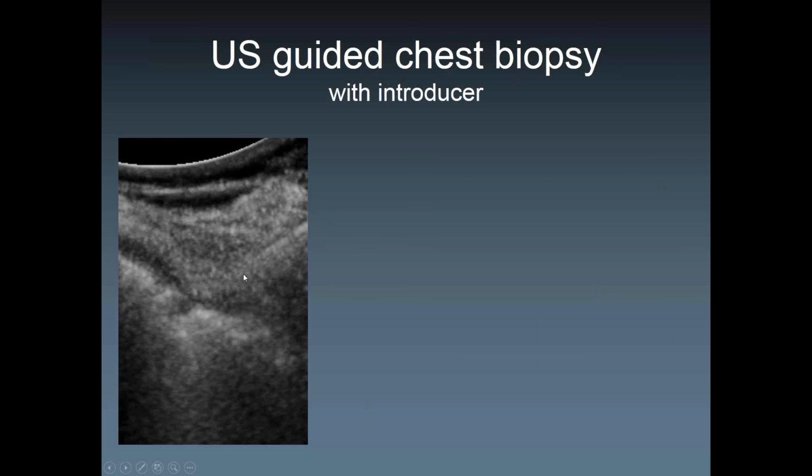Okay, with ultrasound, it's important to know your tools, right? That's why we always insist on you guys trying to, after you learn the whole anatomy and pathology, learn how to scan, at least to some degree. You know what all these gizmos here mean, not all of them, but at least the most important ones. For example, C stands for compression in some vendors. Compression is like the window in CT, right?